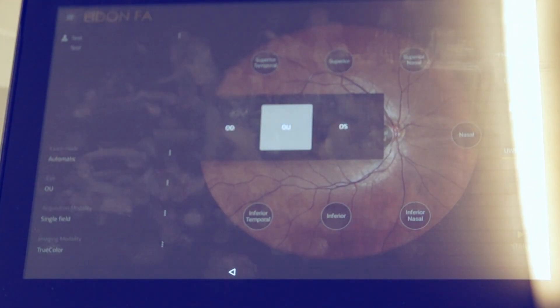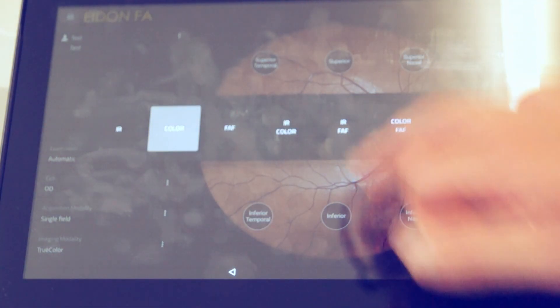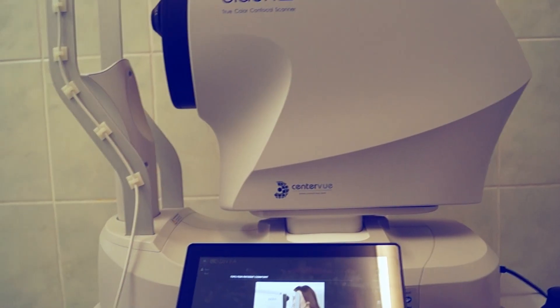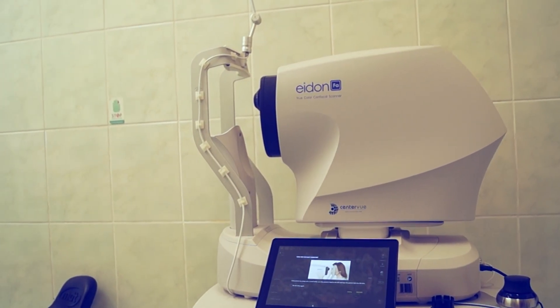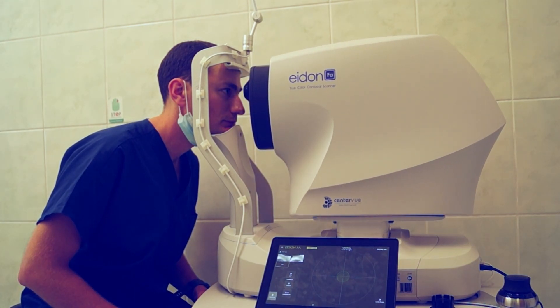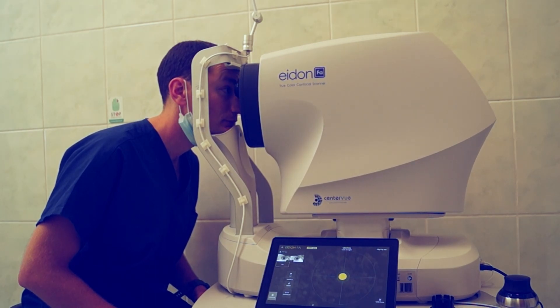Let's take a photo — I'm going to self-administer the test on my own right eye. I'll select single field with infrared and color. There's a pop-up explaining how to get the best photos, but you can dismiss it. There is no other technician. My pupils are not dilated. All I do is take off my glasses, put my chin on the chin rest — there's a slight click because there's a sensor in the chin rest. The machine won't take a shot unless the patient's chin is actually on it, which is very nice.